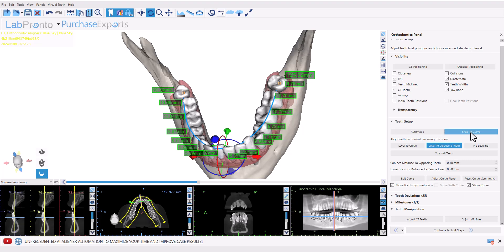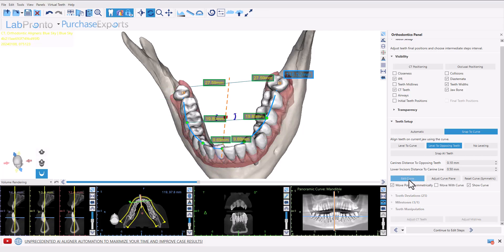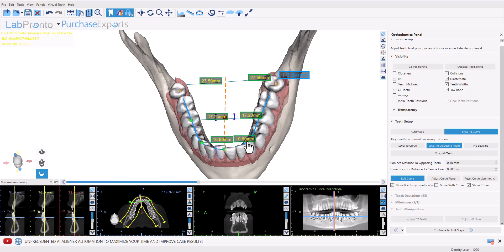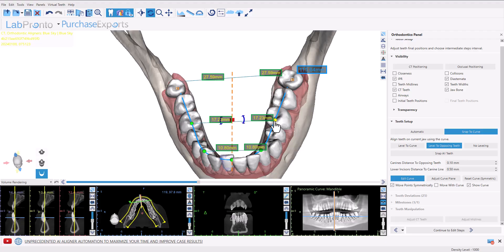Simply choose the snap to curve option, confirm that the show curve checkbox is checked, and click the edit curve button. You now have the option of grabbing the nodes along the curve to drag them to the desired position. You can see that the total curve length visible on screen adjusts accordingly.